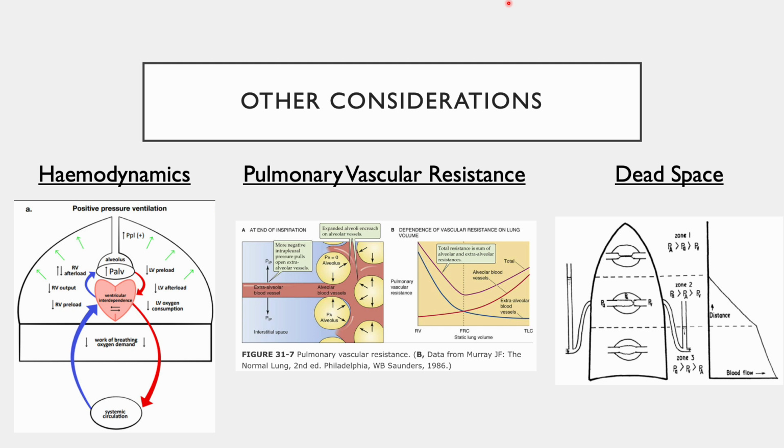In the context of ARDS, over-distension from overzealous PEEP is a risk factor for acute cor pulmonale. Hence, attention should be paid to the RV function in particular. On the other hand, PEEP is often very effective in assisting patients with left ventricular dysfunction, both by reducing the LV preload and a reduction in the LV afterload through a reduction in the left ventricular transmural pressure.